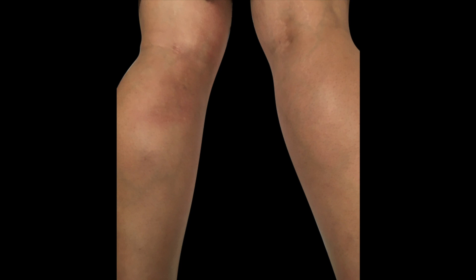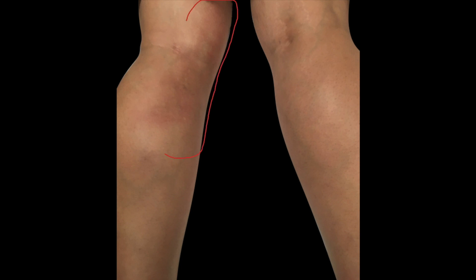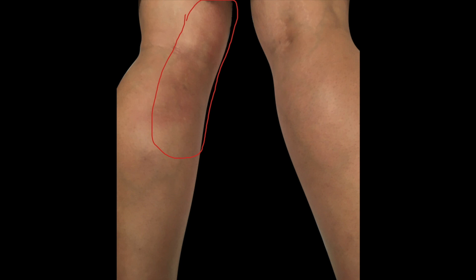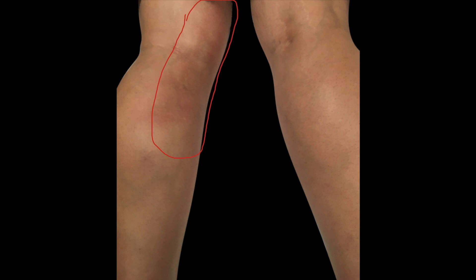This is back to the patient we've seen through many of the videos. She complained of pain, redness, swelling, and increased warmth to this area of her posterior left leg. She was a housekeeper who had been up and down on step stools, had been working on her knees cleaning floors, and had developed some pain a few days previously, and the pain seemed to be isolated to this area only.